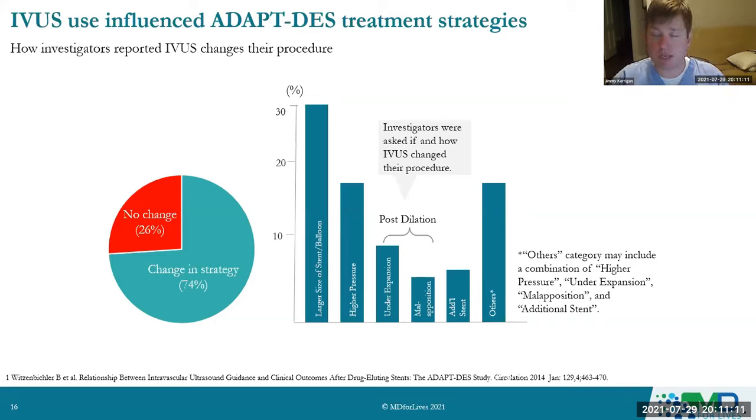And usually it's that they picked too small of a stent. And again, small stents lead to in-stent restenosis and stent thrombosis potentially. Otherwise, people wanted to pick additional stents. They found that their stents were malopposed. So this would posit that for expert angiographers in the recent era, intravascular imaging does change things compared to an angiogram.